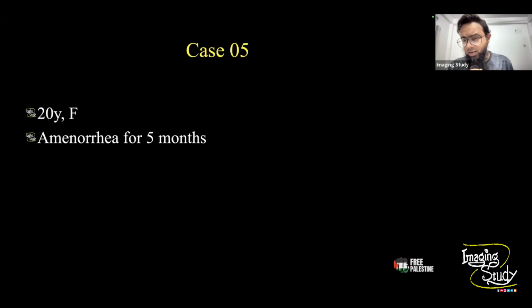Let's jump into case number 5, this last case. And this will obviously be a pregnancy case. I have got many congenital anomaly cases in the last month, so to share them one per week, it will take a very long time to end. Anyway, let's jump into this case.